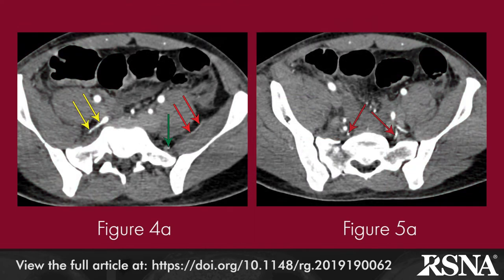Figure 4a. Axial CT angiogram in a 35-year-old man shows the right iliolumbar artery (yellow arrows) arising from the posterior division of the internal iliac artery and following a horizontal outward trajectory anterior to the sacral ala. It bifurcates at the pelvic inlet level into the iliac (red arrows) and lumbar (green arrows) branches. The iliac artery is seen anterior to the iliacus muscle, and the lumbar artery runs vertically anterior to the sacral ala on the left side.